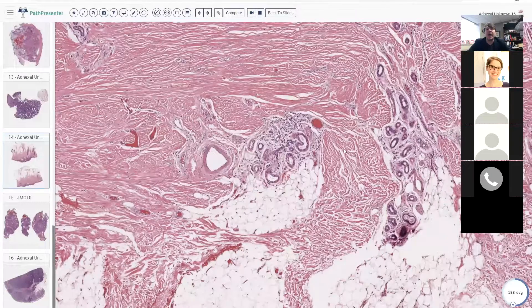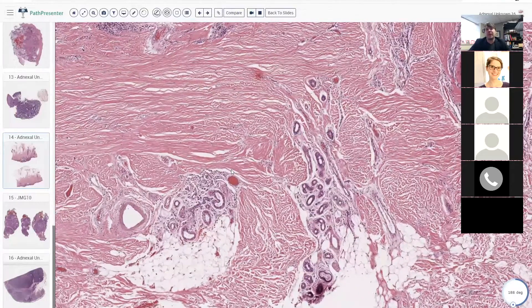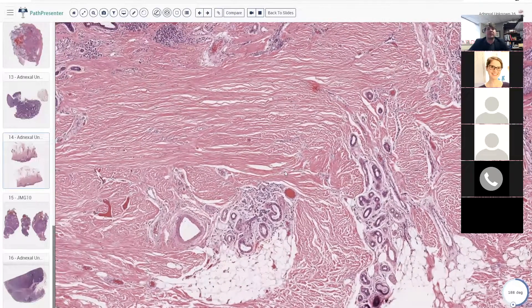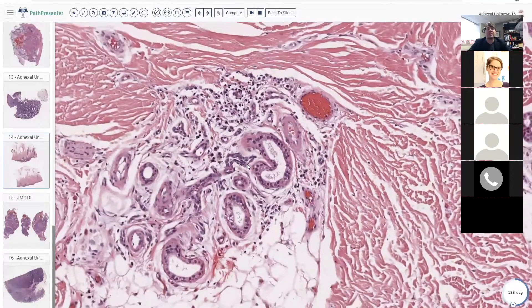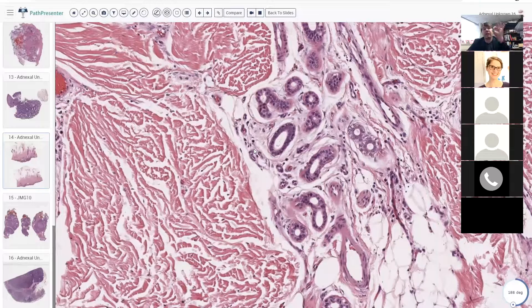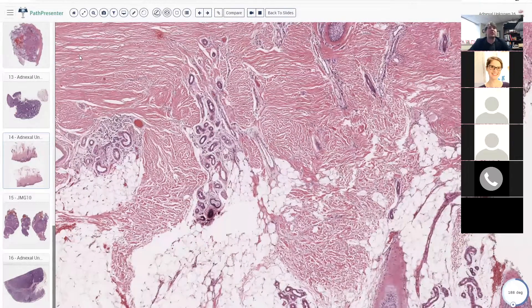Another little clue that's sometimes present is you'll find apocrine glands underneath the lesion. They're not always present, but when you see them, that's pretty helpful, because apocrine glands don't normally exist in the normal scalp — they're normally limited to the anogenital area and also the glands of Moll along the eyelids. So if I see apocrine glands, or sometimes glands that look like eccrine glands but have larger apocrine-looking nuclei with little punctate nucleoli — apo-eccrine glands, some people call them — those are all nice clues for nevus sebaceous.